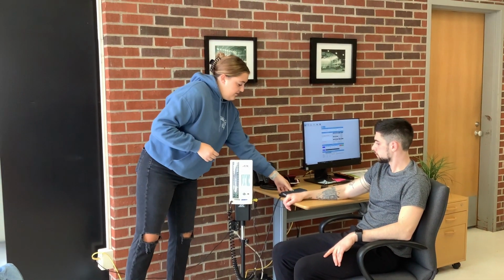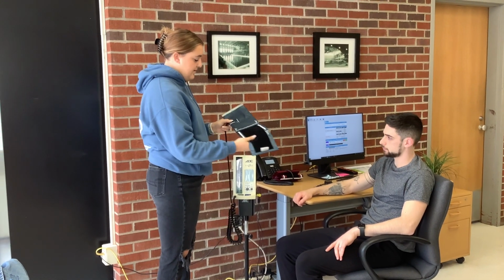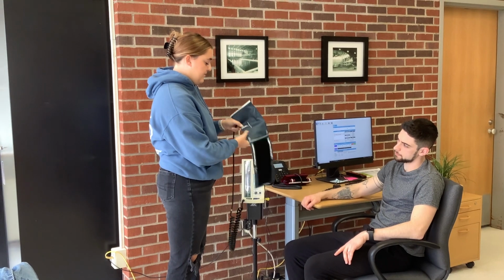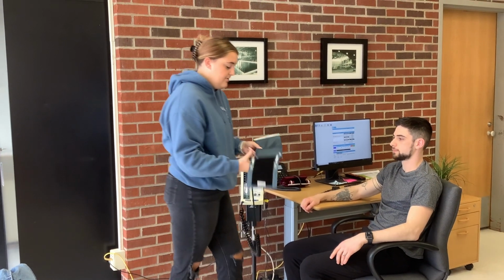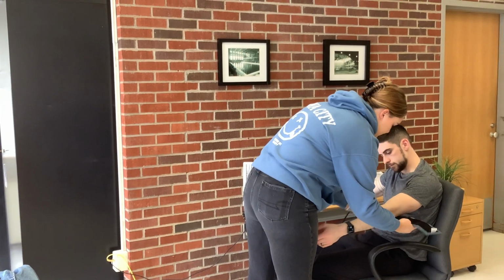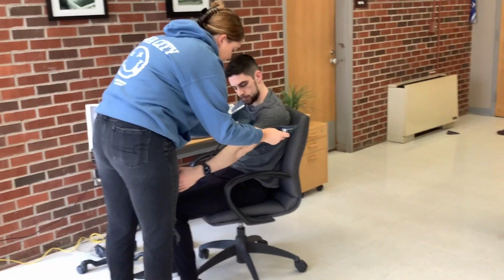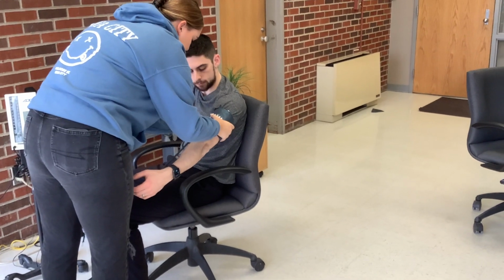So for the blood pressure reading, it's pretty simple. It'll tell you on here if you need to select a smaller cuff. It'll also have where their arteries should line up, and then if they should select a larger cuff as well. So the participants know that they'll be getting their blood pressure taken, so they'll probably have a short sleeve shirt on, which is good. So I just like to wrap this tightly around there.